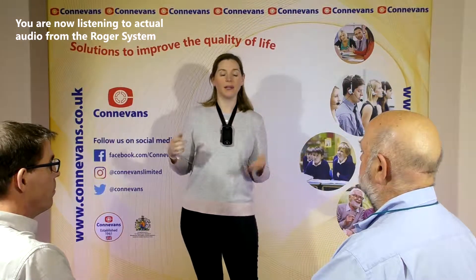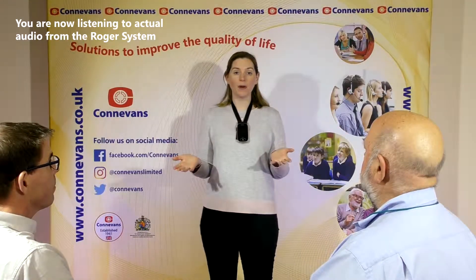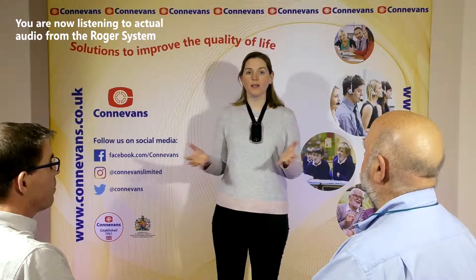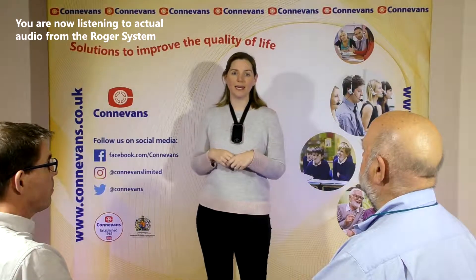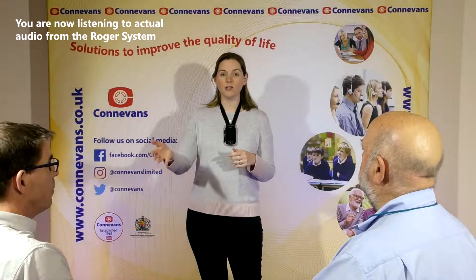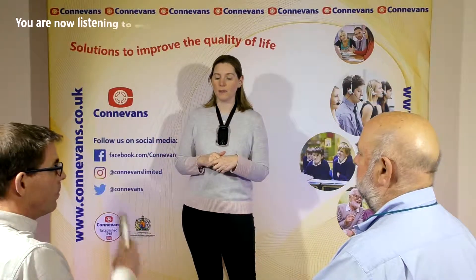This is a classroom simulation for a Roger touch screen microphone. I'm being the teacher and I'm wearing a Roger touch screen microphone around my neck. We also have a couple of pass around microphones in our network. You can have up to 35 Roger transmitters in a network, two of which can be active at the same time. Tony is a student joining the discussion with a pass around microphone.